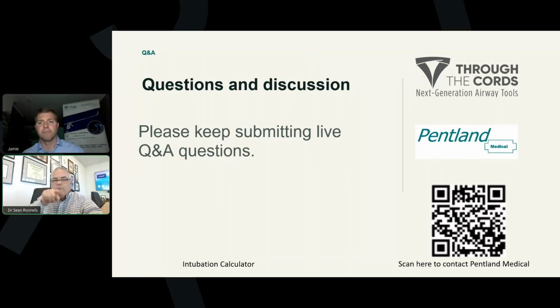So when I'm talking to medical students and residents, I always say the system is operator, tracheal access, and visualization. Visualization determines the tracheal access geometry and the tracheal access tools you should be using. But remember, that system is always being executed in a context. And the context of the ED and the ICU is very different. And that accounts for a great deal of the differences in outcomes there.